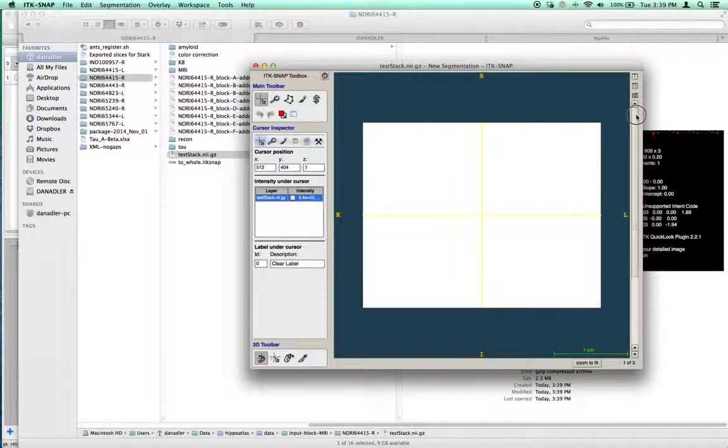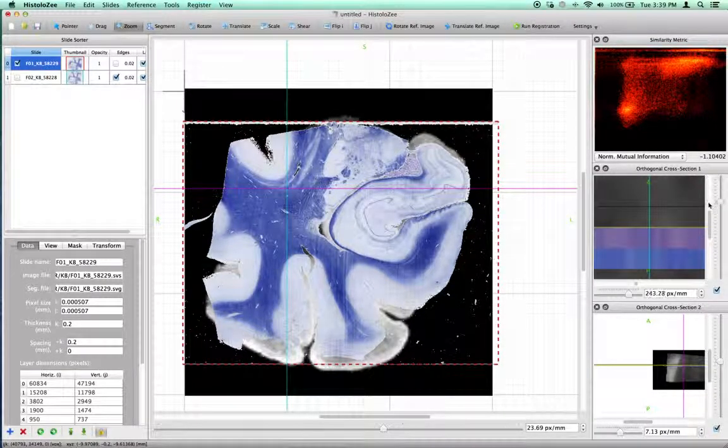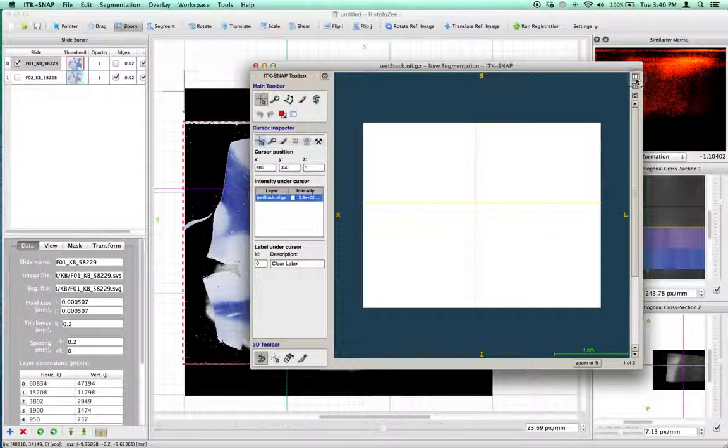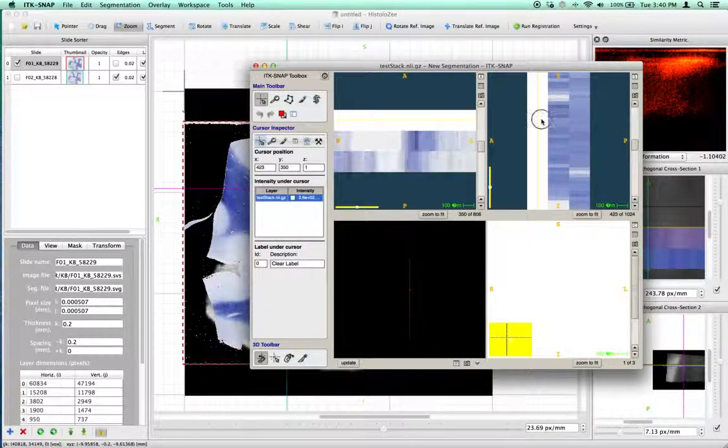You might be wondering why we have this additional blank slide. Well, that's because in our reconstruction project, there is this blank space between the origin plane, the k=0 plane, and our first slice, which is represented here by a blank slide. And if we zoom into the other views, you can see the slides here.